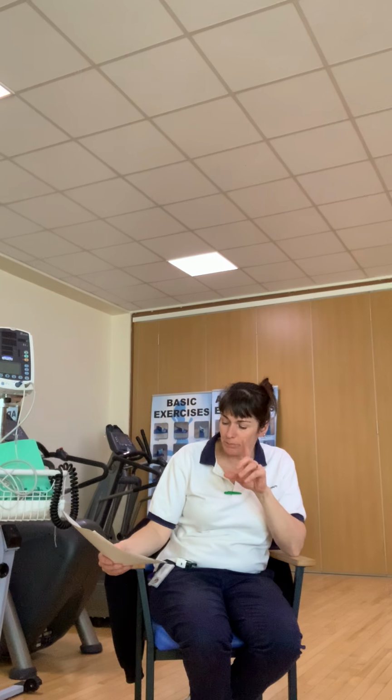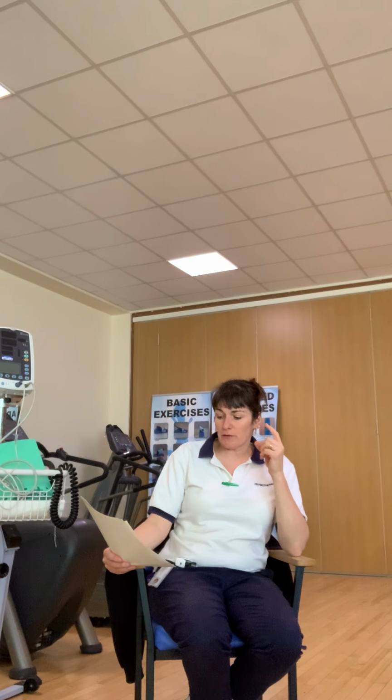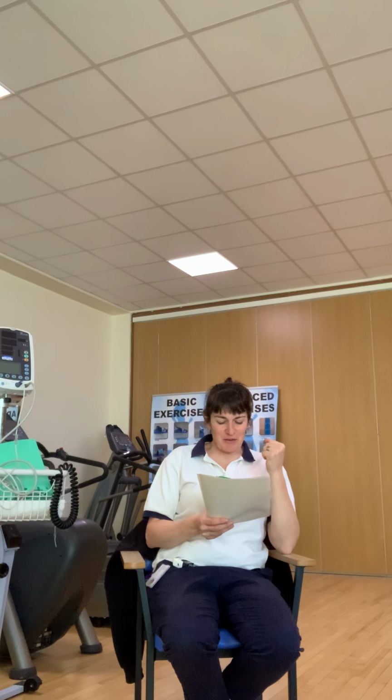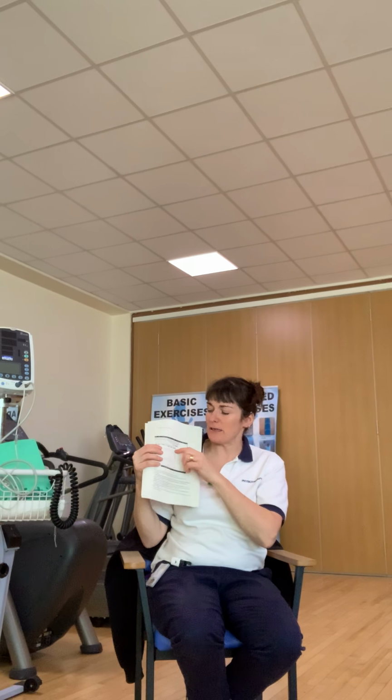Right. When you actually get up to your patient observation screen, when you actually get them up, what you'll come up with is then the whole kind of graph. You'll probably see a sheet, with the readings on there. There's some real key kind of things. It's a bit like looking at X-rays and radiology. Always check you've got the right patient. I've always had loads of people, including myself, that have done that. And make sure it's an up-to-date OBS recording. So the date should be right at the top. Can you see? It's really badly printed out, but right at the top there's a date. I know, get your glasses on. But there's a date there, and there's a patient name.